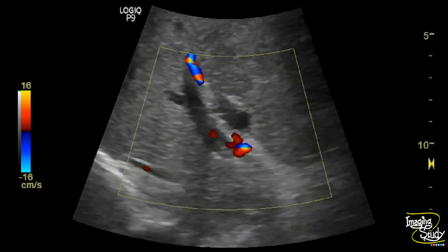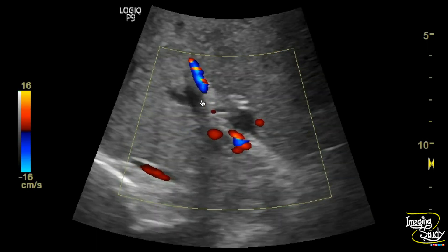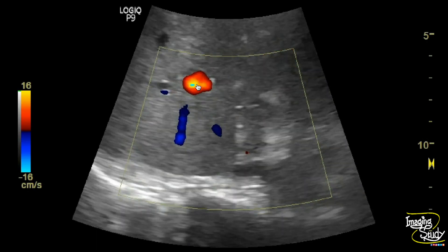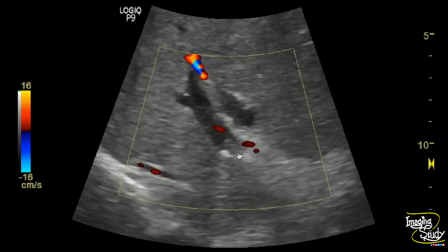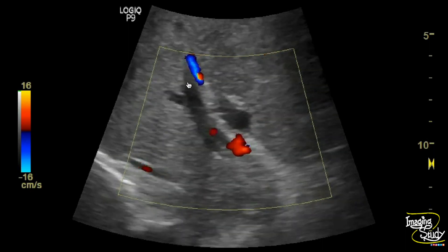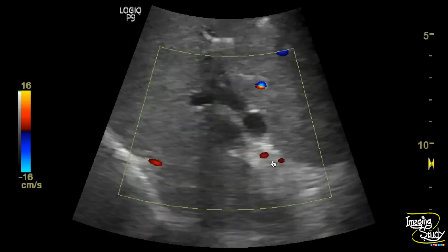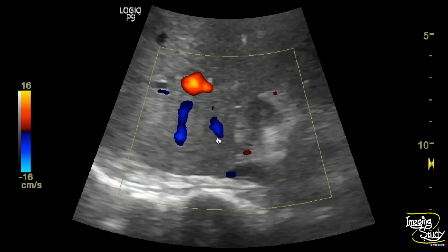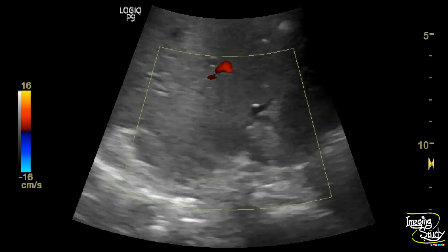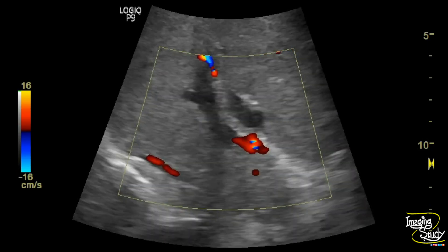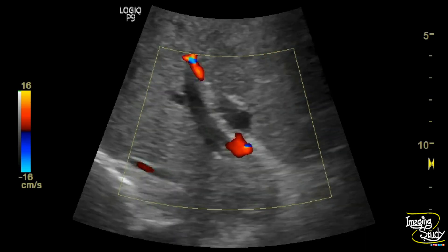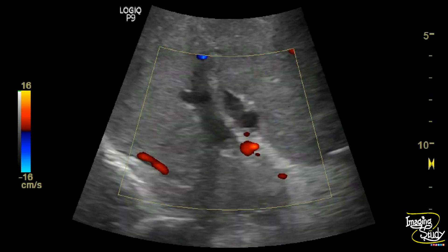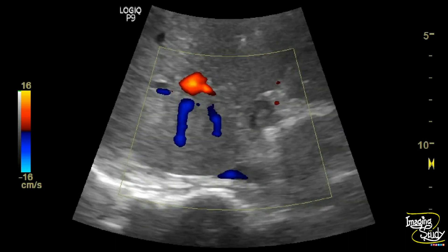Now when we put the color Doppler over the portal vein, prominent flow from the hepatic artery is seen. But there is no flow within the portal venous lumen and its main branches. There are low-level internal echoes also noted, indicating a case of portal venous thrombosis. Having found a space-occupying lesion in the liver and portal venous thrombosis, we want to find the cause of these lesions.